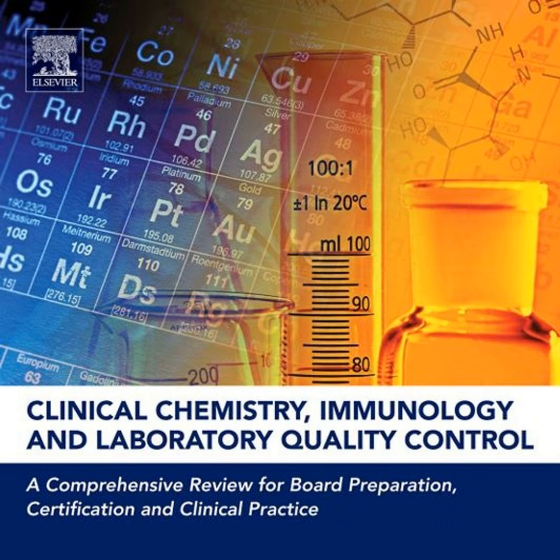Okay, let's pivot from the practical errors to the stats. The quality control that ensures the lab is reliable. We have to define two core concepts, precision and accuracy. Right. Precision is just reproducibility, how close repeat measurements are to each other. Accuracy is how close that measured value is to the true target value. And that distinction is vital. It is, because you can easily have an assay that is highly precise, all the results cluster tightly together, but it's consistently inaccurate because of a systematic error or a calibration drift.